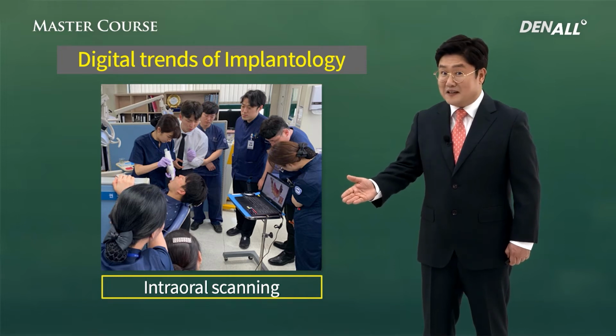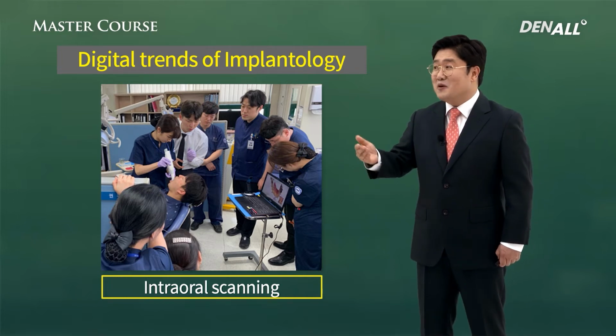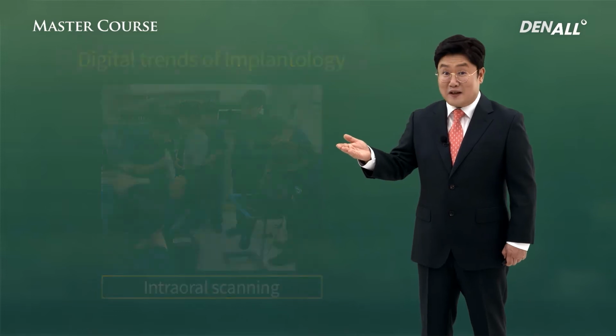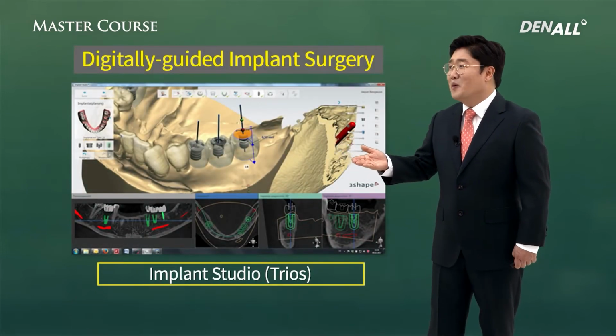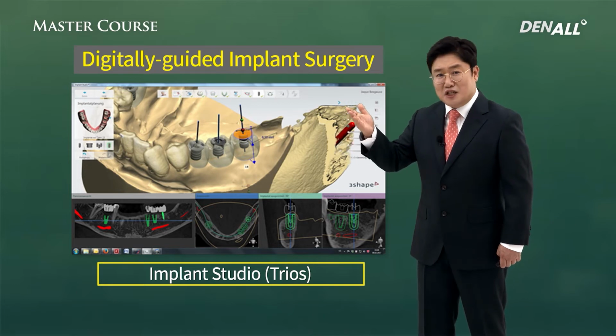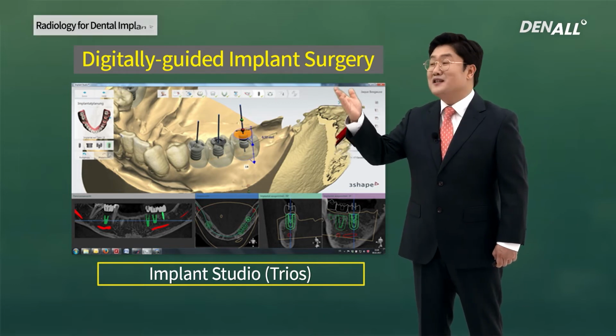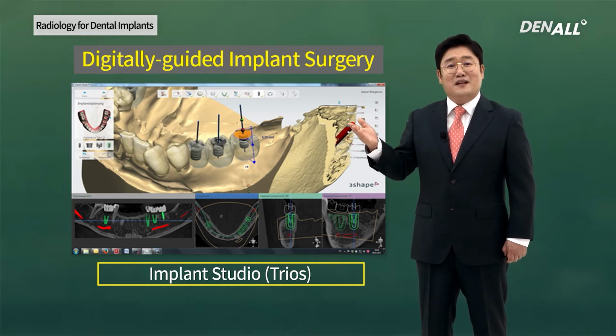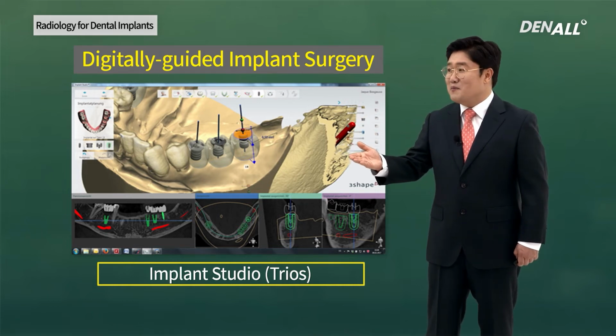Intraoral scanning is done to acquire information of the oral situation. The information can be put together, and three-dimensional, more accurate information can be used for the digitally guided implant surgery. There are programs to plan for such surgery.